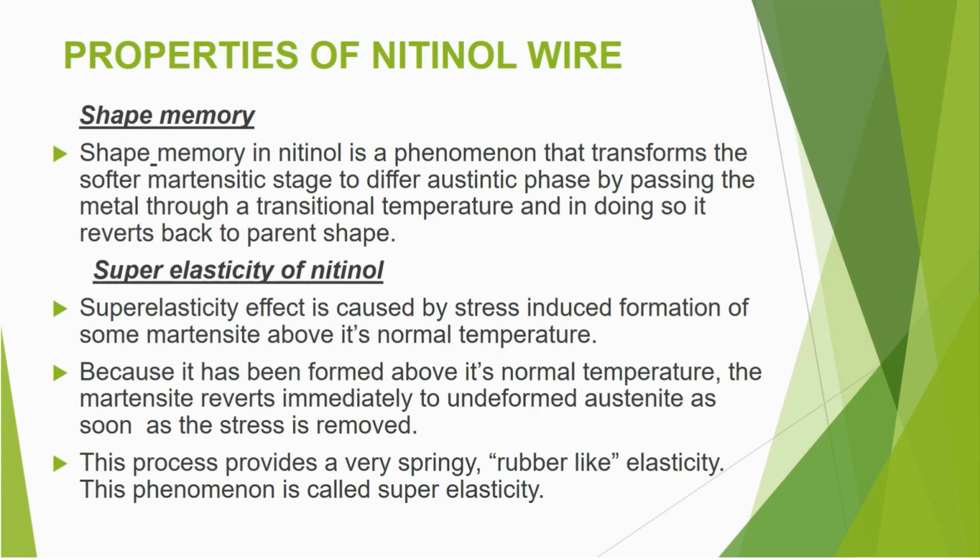Properties of nitinol wire. First, the shape memory. Shape memory is the phenomenon that transforms the softer martensitic phase to the austenitic phase by passing the metal through a transitional temperature, and in doing so, it reverts back to the parent shape.